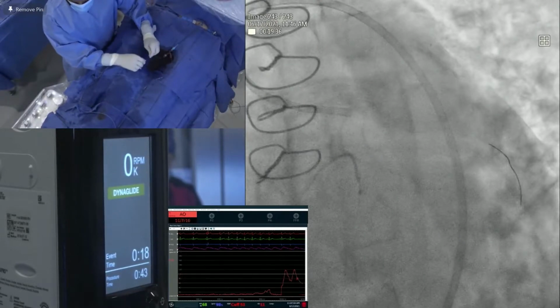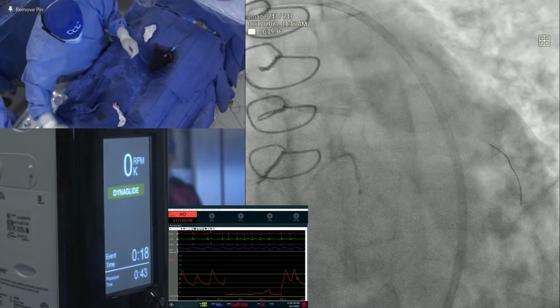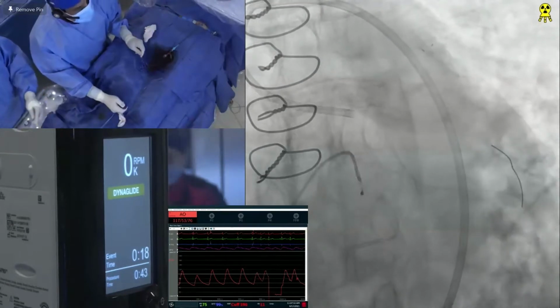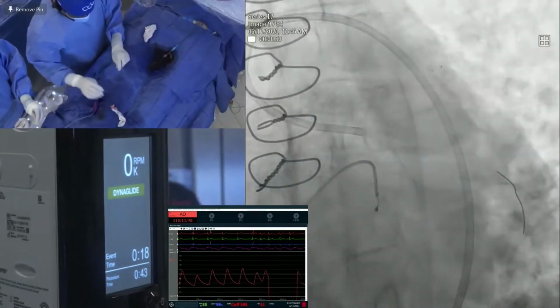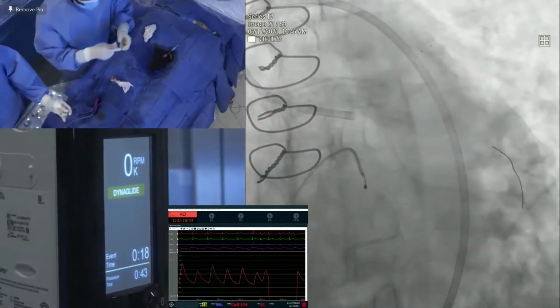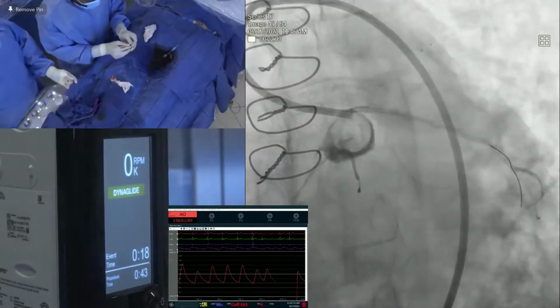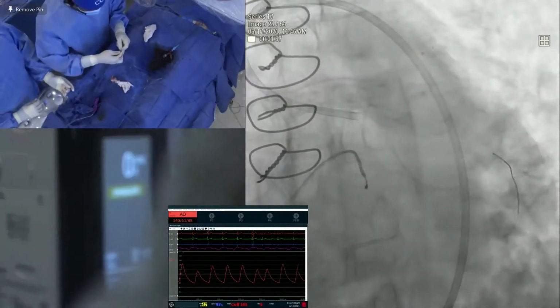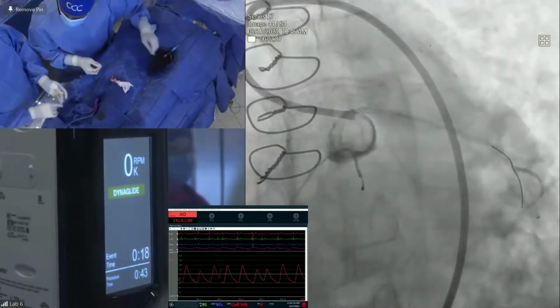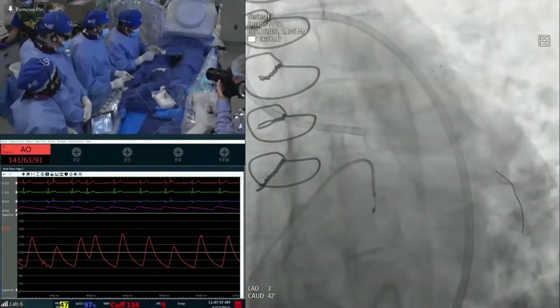So now we have done the rotablation. We'll put a wire side by side and go to the high pressure balloon. 4.0? We have 4.0. No, 8. We need a short one. Right now we need a short 3.5 or 4.0. Remember, we cannot have the long balloon. You need to expand a short balloon, knowing that we don't have an open NC, which Colombo spoke about, which can go to 40 atmospheres. So you'll take a non-compliant short balloon and really push it out in that area.